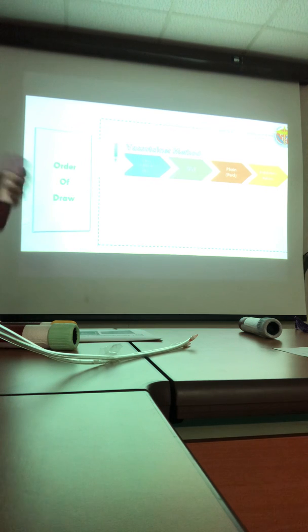If you check the tubes, all the preservative or anticoagulant is in a powder state, except this one, liquid. So I need 1 unit of anticoagulant to prevent clotting of 9 units of blood. 1 to 9, this is the ratio.